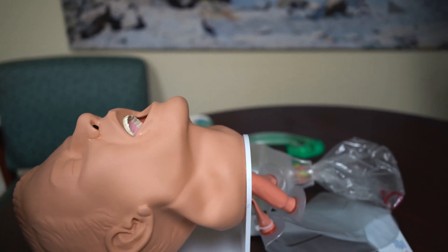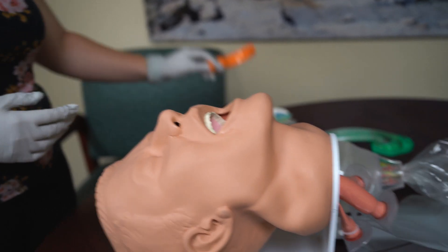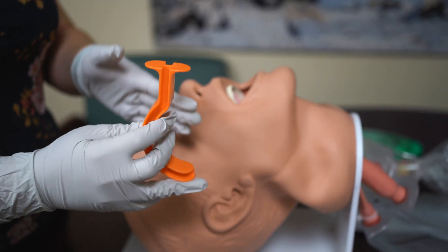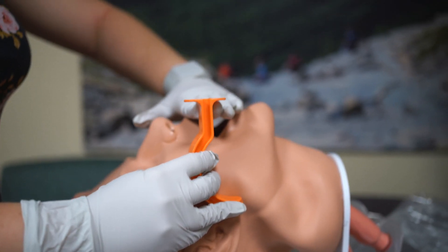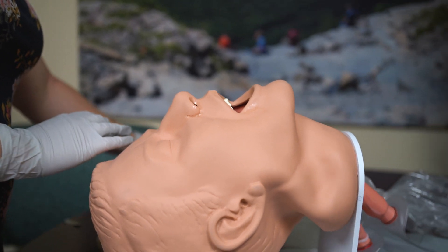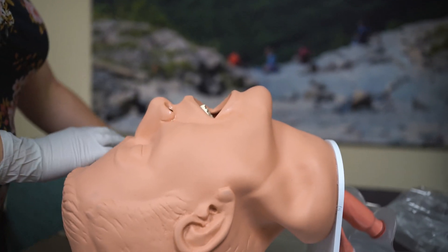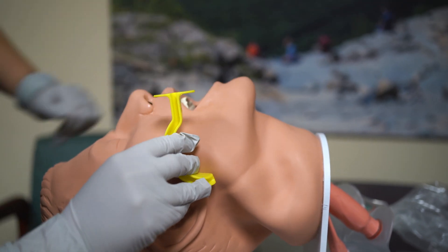Once the patient's airway is clear, I want to open it and keep it open with an OPA. I'm going to measure it — I want this piece to sit on the patient's teeth and hold the tongue, so I measure from about the earlobe to the top of the teeth. This one is too large, so I'll try another. This one looks a little tall as well. That one looks like our best bet.